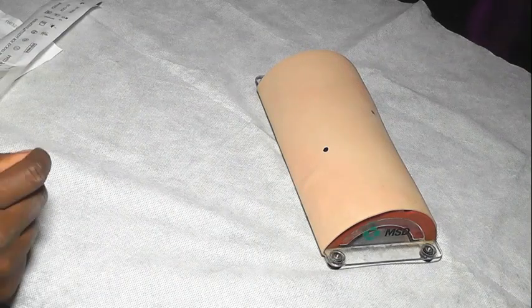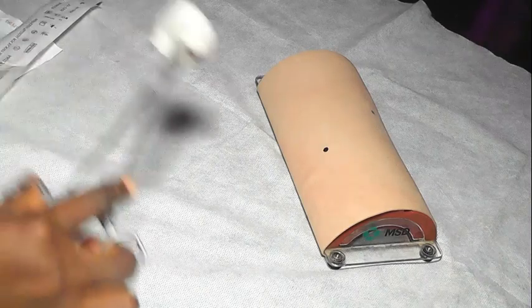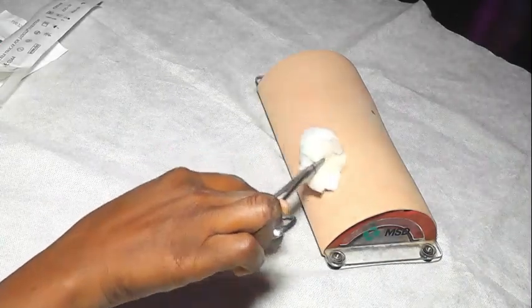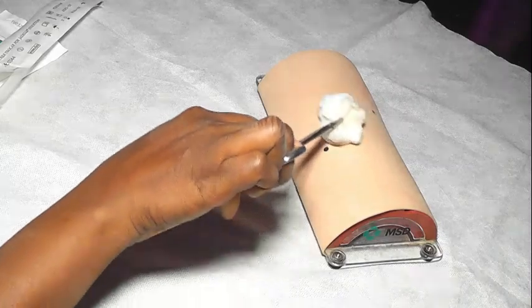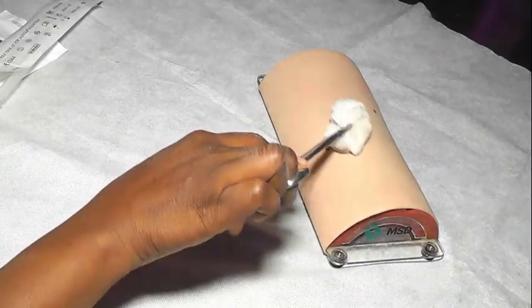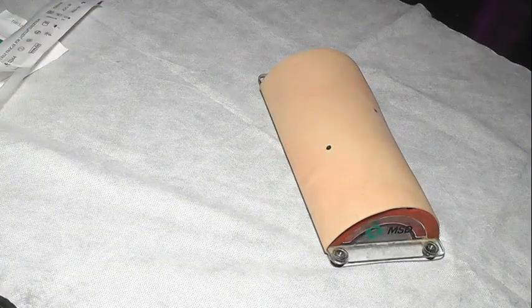Okay, now the next thing to do is to clean the site. So you pick your gauze that is soaked in an antiseptic solution. You clean the site for the insertion. Okay, you go in a circular motion, and then you discard. So you allow the site to air dry.